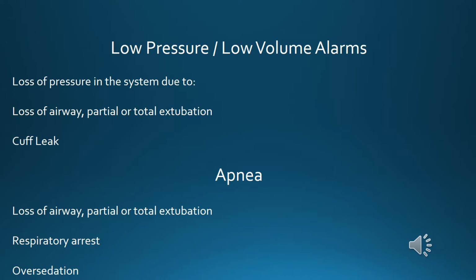Yes, they will desaturate during that arrest period. Typically, it's set at 20 seconds, and then it'll kick back into full ventilation mode, which is just control at a rate of 12 and a volume appropriate for the patient, 500, 400, somewhere in there.